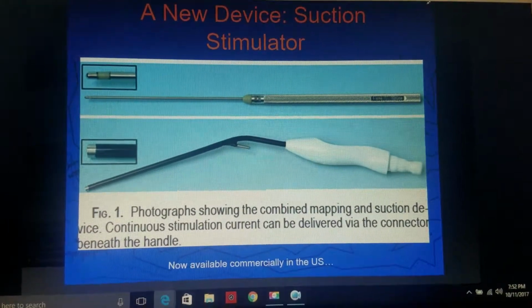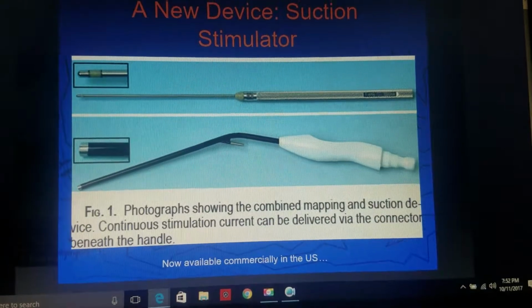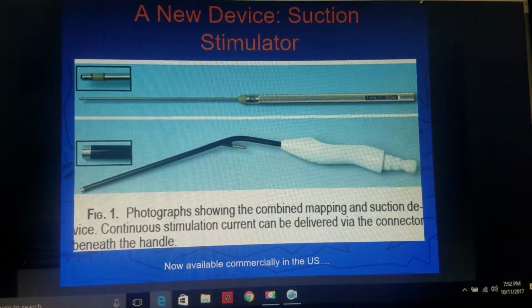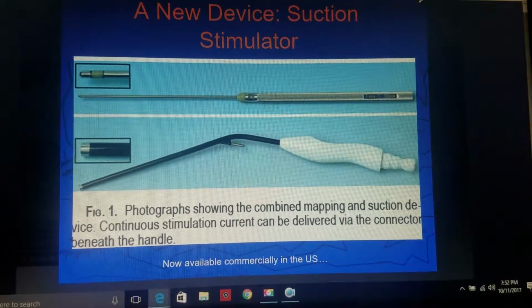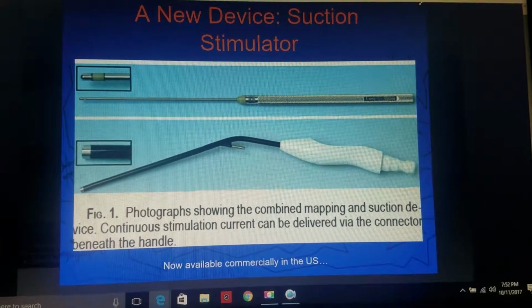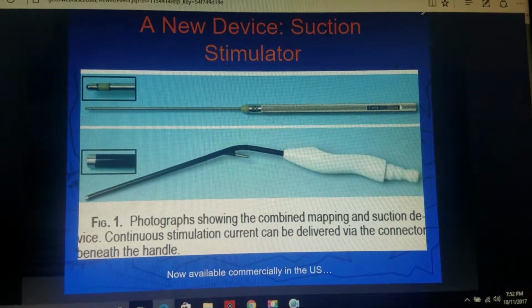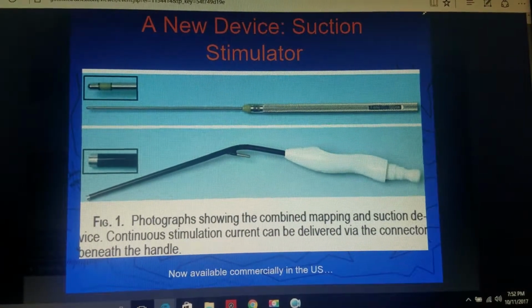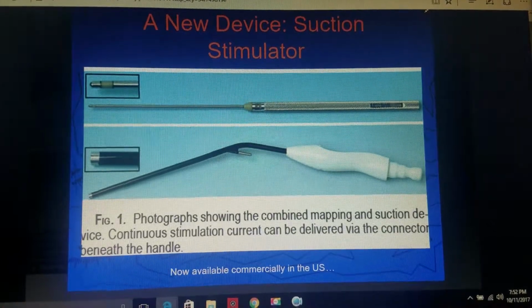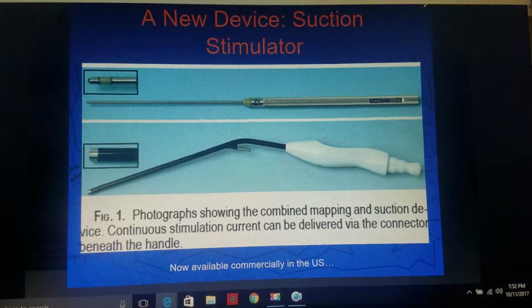And as you know, the surgeon almost always has suction. I mean, when does the surgeon not have a suction in her left hand and whatever other instrument in her right hand? And the answer to that question is obviously when she's left-handed. And then she uses the suction with her right hand and the CUSA or whatever in the left hand. So there is always suction in the field to dry the field.